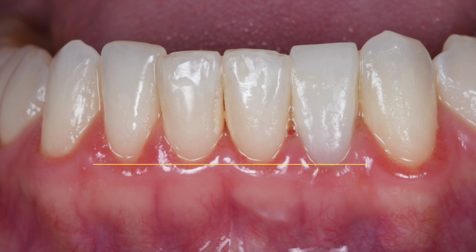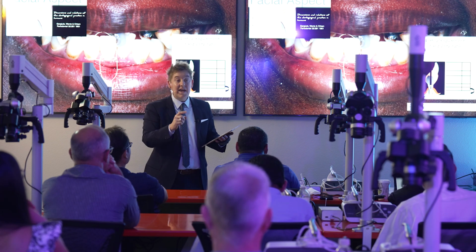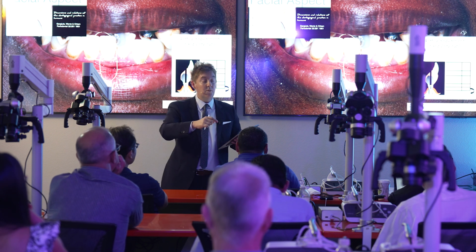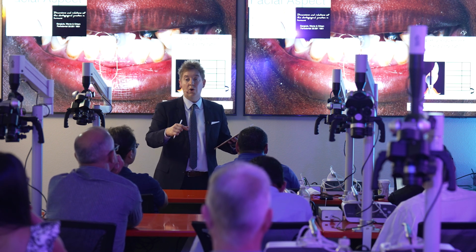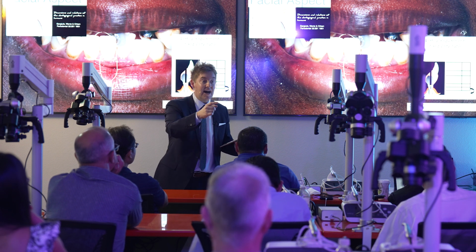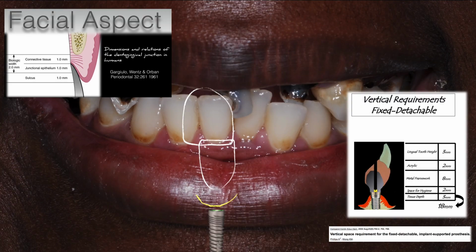That's not our patient. That's where the implant would go if we were just trying to give her natural teeth. And maybe we could, as a matter of fact. We could put the implants there and we could give her a prosthetic that is all white with no pink. But that's not a hybrid. That's a much more expensive prosthetic. We're going to do those today as well. But if we want to go with a hybrid, we need 18 and we need the implant there.